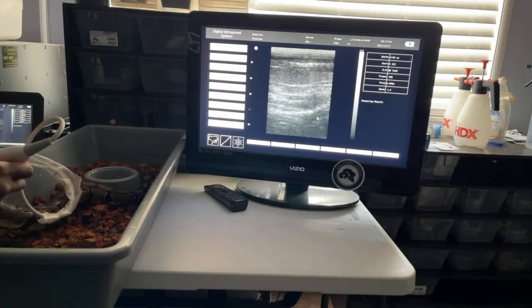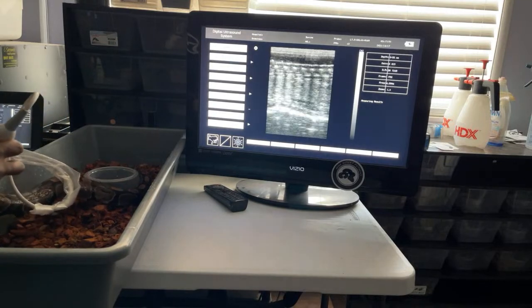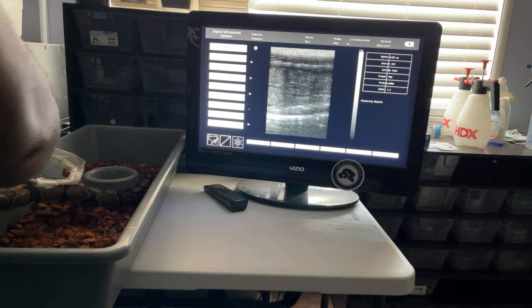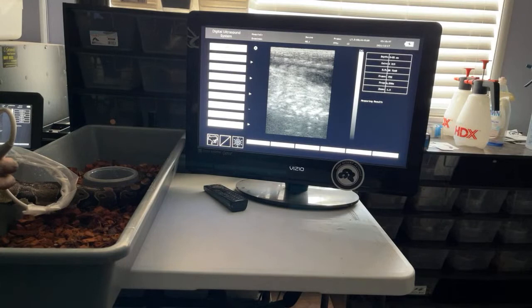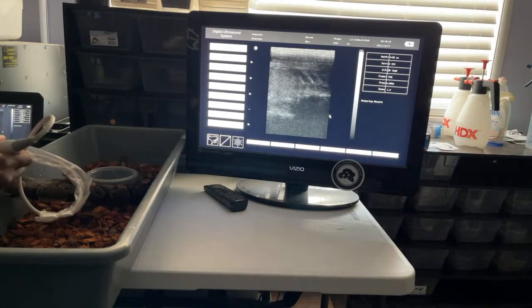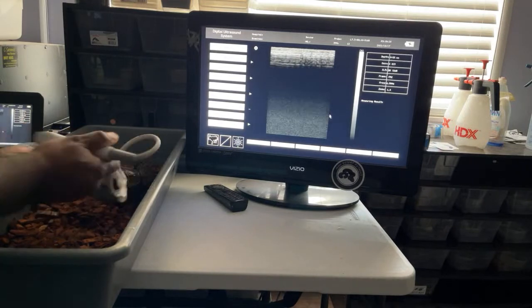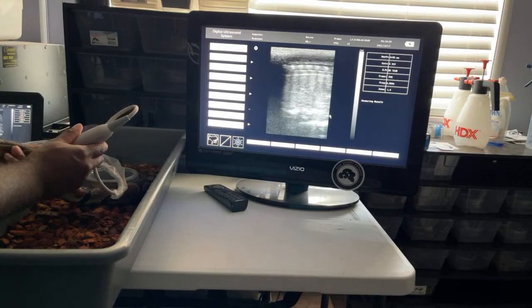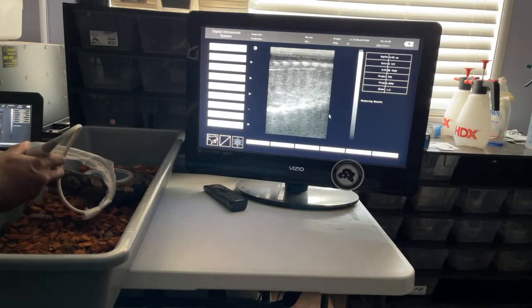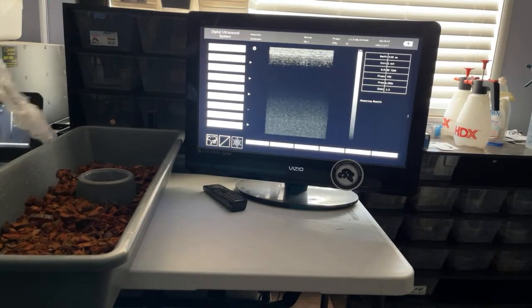Gallbladder right there. I think we just went by. You might hit freeze, I'll tell you. Right there. Get clear. You can probably see it right there. But she's squirmy as hell too. It's like she knows I'm on her follicles. She's like, no, not right there.